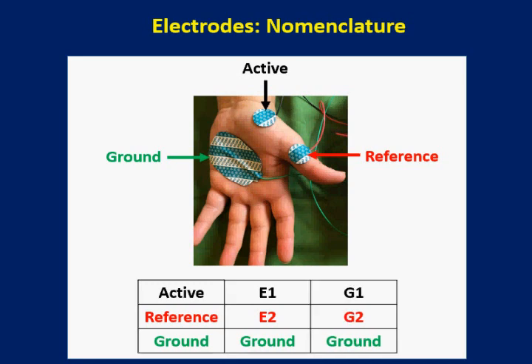Some use terminologies like G1 and G2. While those terms reflected the connections to different grids of a vacuum tube used to build an amplifier, that technology became obsolete decades ago. Hence, we suggest that terms G1 and G2 should not be used.